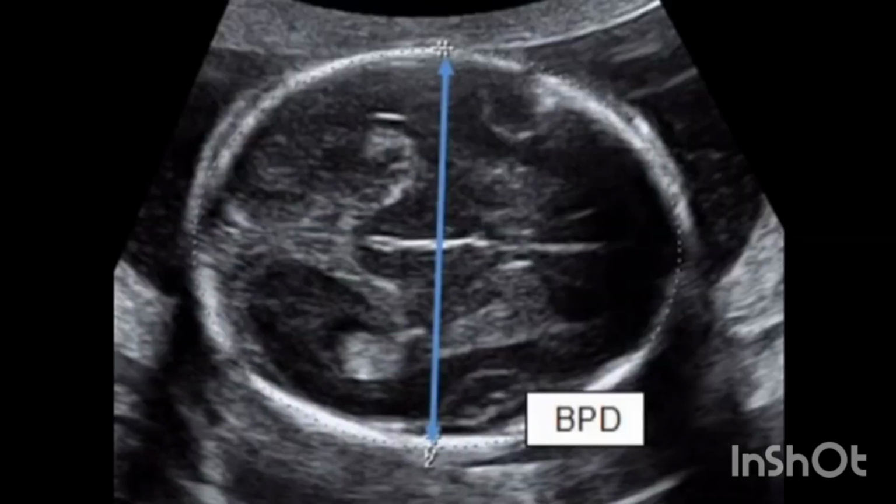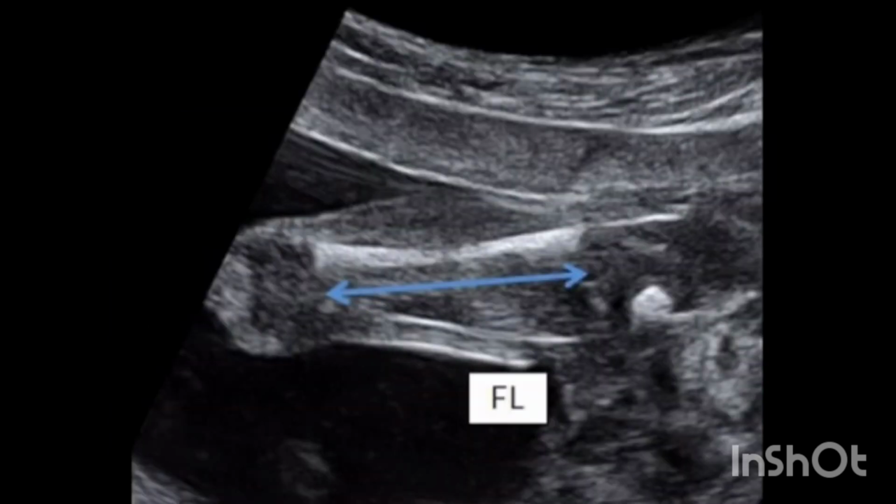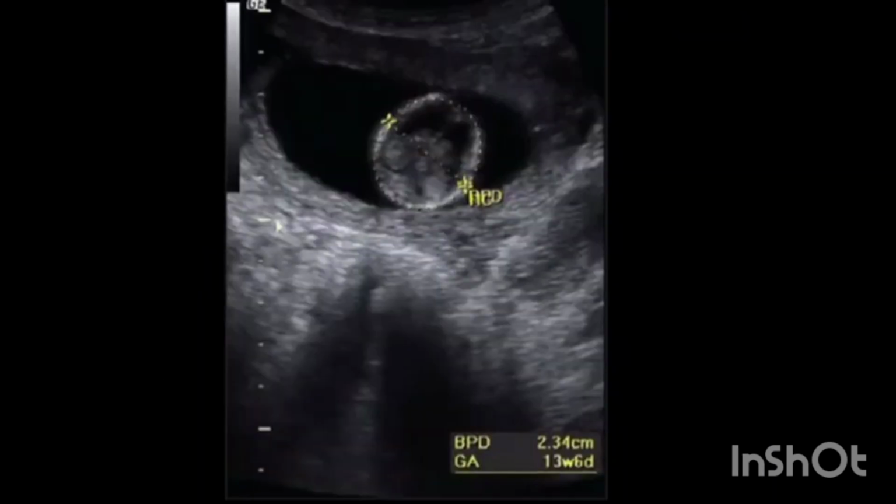Is biparietal diameter accurate during the third trimester? The biparietal diameter in the third trimester is not reliable and can be useless when the patient passes 30 weeks. In those cases, the biparietal diameter has to be used alongside other measurements when we take it in later trimesters, to emphasize the normal growth of the fetus and avoid wrong measurement by ultrasound.